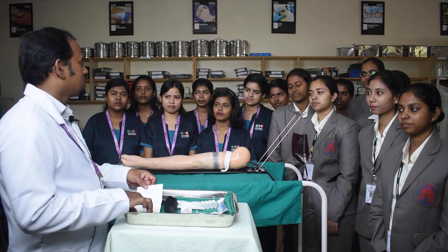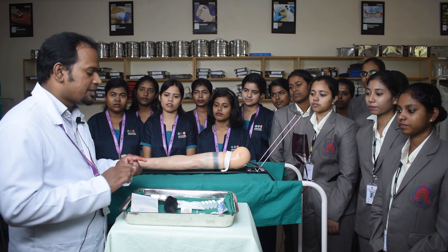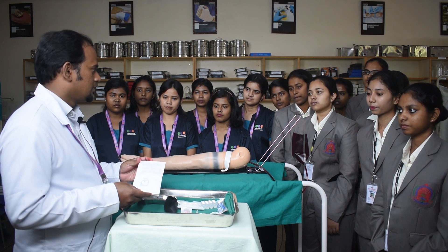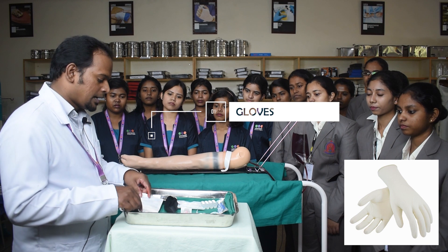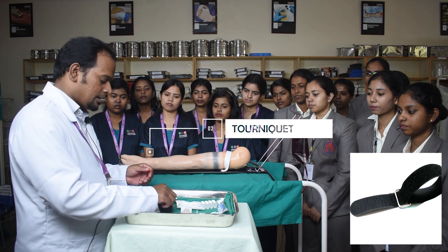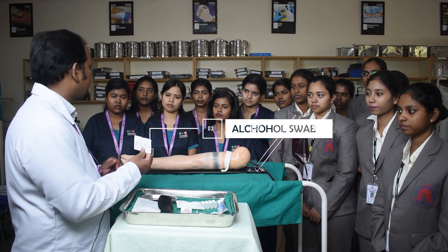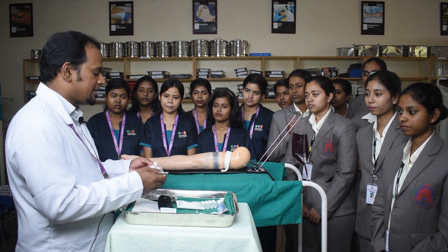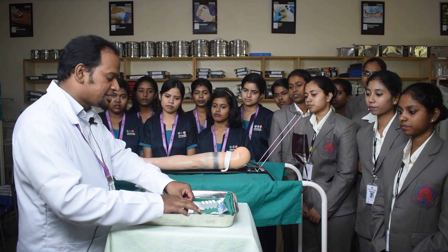Now let us understand what articles are required for IV cannulation. Firstly, a tray containing gloves of your choice — my glove size is 7, so I have taken size 7 gloves. You also have a tourniquet to tie around the arm, and an alcohol swab to clean the IV cannulation site. Next, you have the IV cannula for insertion.